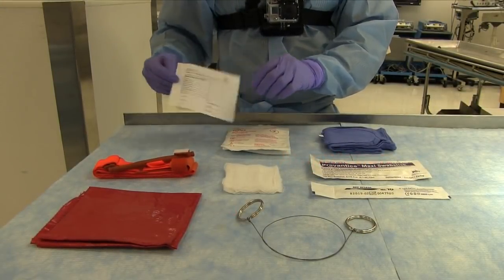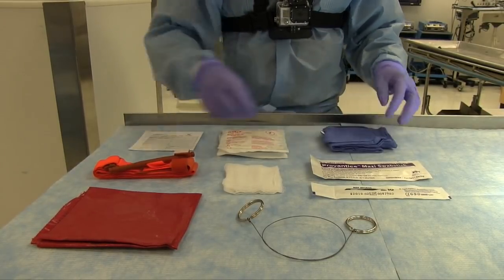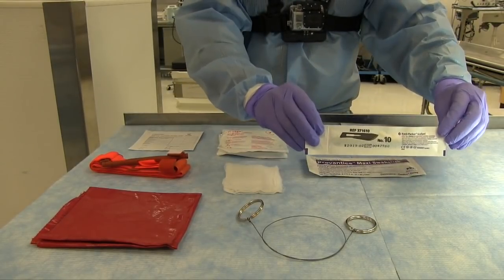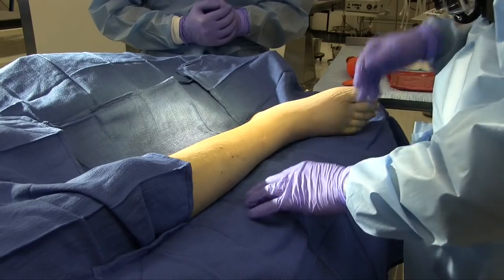First, we'll go over the contents of our kit: several pairs of sterile gloves to fit most hand sizes, several pairs of blue sterile operating room towels, a standard combat application tourniquet, chlorhexidine swabs, a 10 blade scalpel, several sterile 4x4s, a biohazard bag, and a Gigli saw.